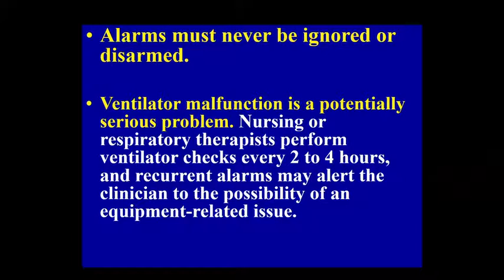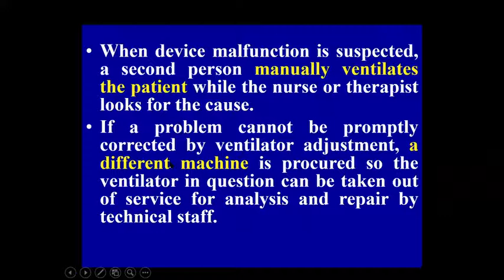When device malfunction, manually ventilate the patient and ask somebody to check the ventilator. So if you think the ventilator is malfunctioning, disconnect the patient, take the patient's care with the vent circuit, and either replace this ventilator with another or ask the specialist who knows about ventilation to take care of the ventilators.